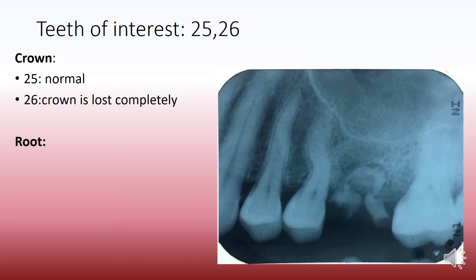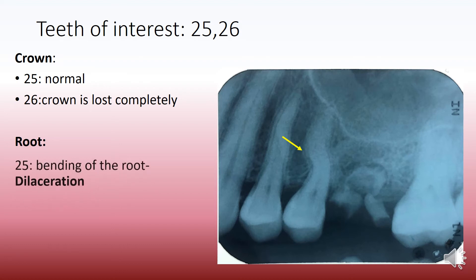The teeth of interest are 2-5 and 2-6. In 2-5 we see that it has a normal crown, but in 2-6 the crown is completely lost and what we see is only the roots. If you notice the root of 2-5, you will see that there is bending of the root, and this is what we call dilaceration.